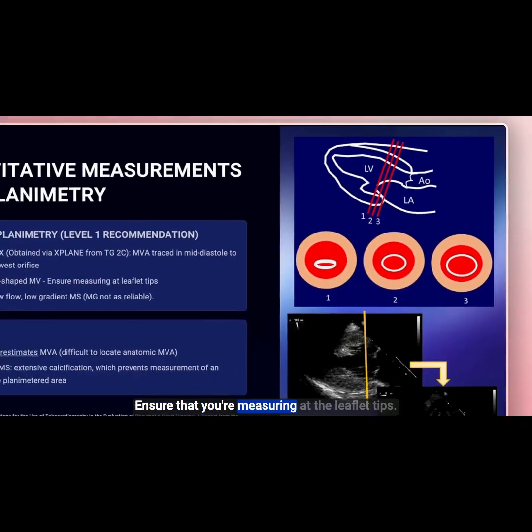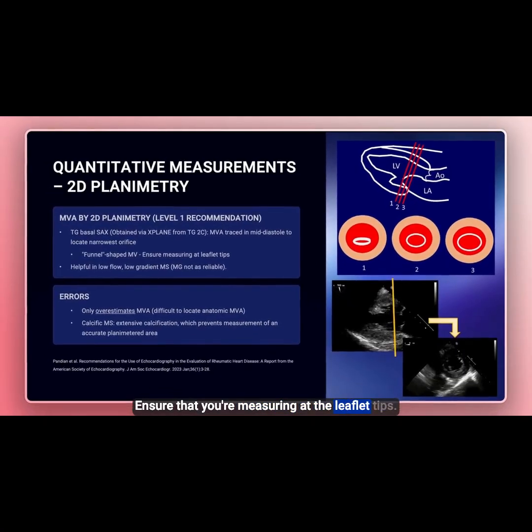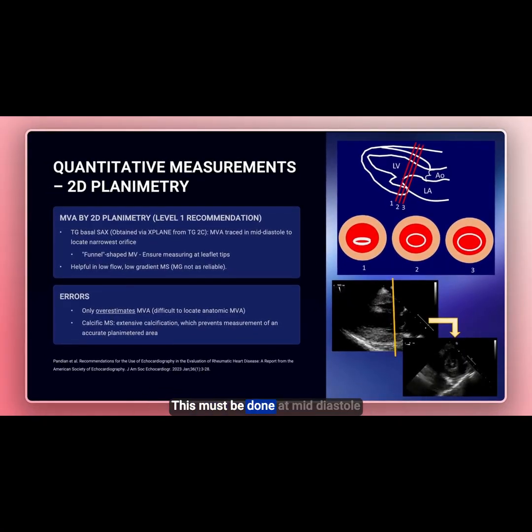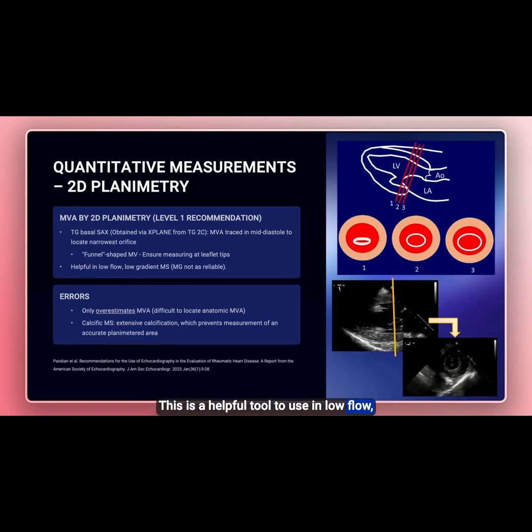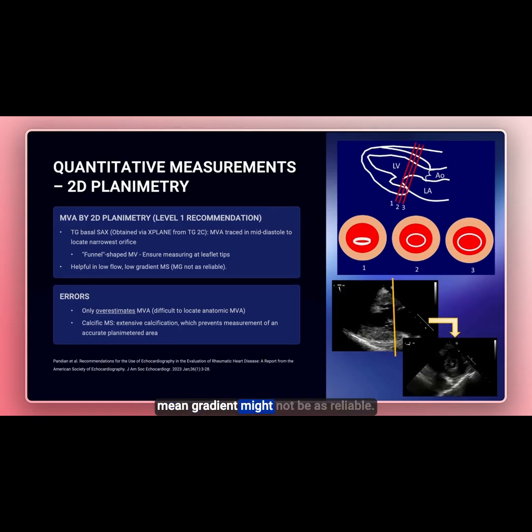Ensure that you're measuring at the leaflet tips. This must be done at mid-diastole when the mitral valve is most open. This is a helpful tool to use in low-flow, low-gradient mitral stenosis, where a mean gradient might not be as reliable.